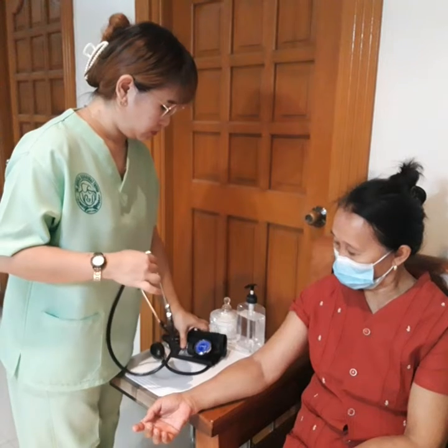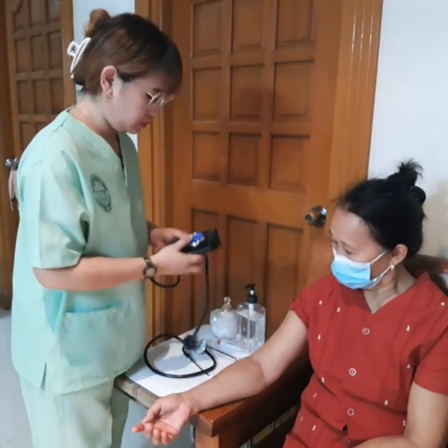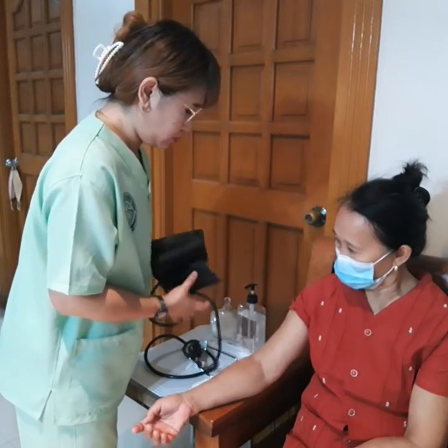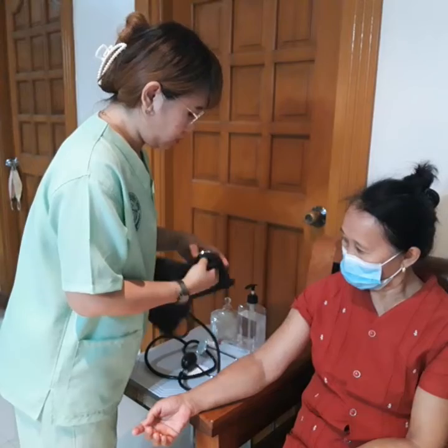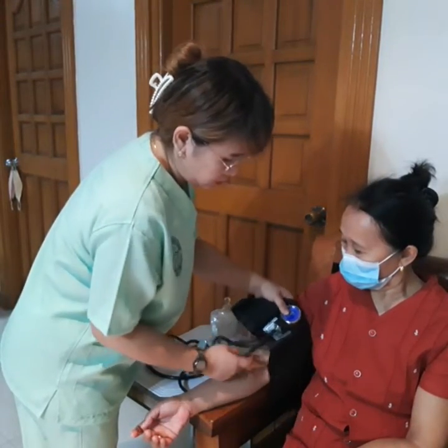Now, after the pulse is located and secured, the cuff may be marked with an arrow to show the location of the stethoscope head. The lower edge of the cuff should be about 1 inch above the bend of your elbow. Make sure that the fabric fastener of the cuff is snug and secured but not too tight.